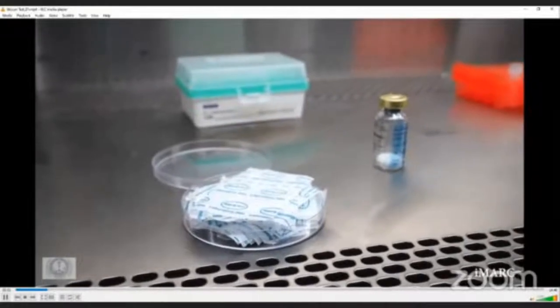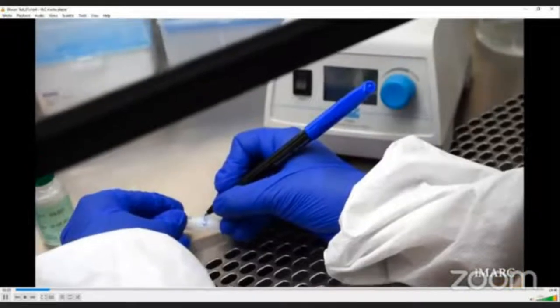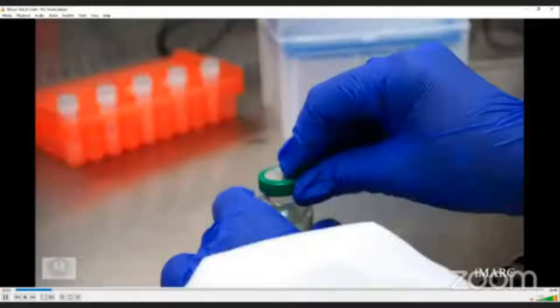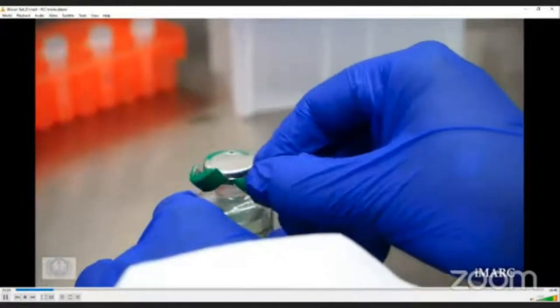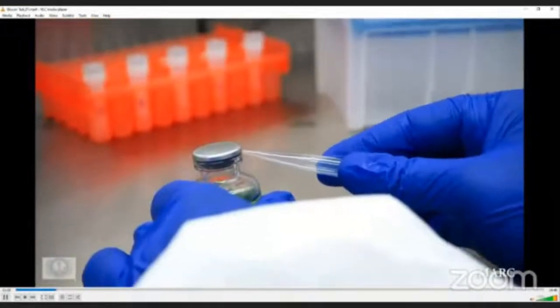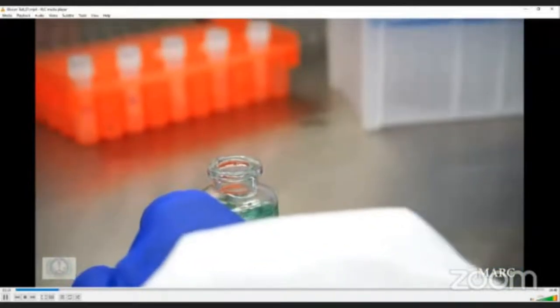Make sure that all the required accessories are easily accessible in the biosafety cabinet to avoid contamination and for proper handling of the pipette. Properly remove the aluminium shield of the reagent vials with the pipette tip, and after the pretreatment, cover the vial top carefully with parafilm. Transfer all serum samples into 2 ml pyrogen-free microtubes in the hood.